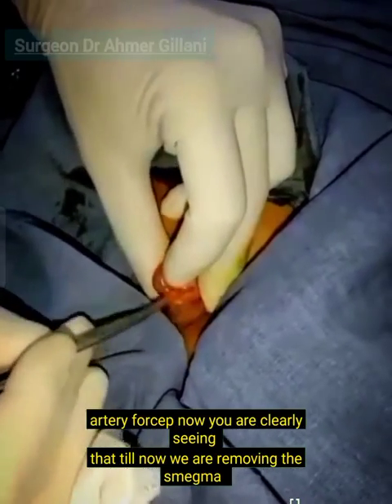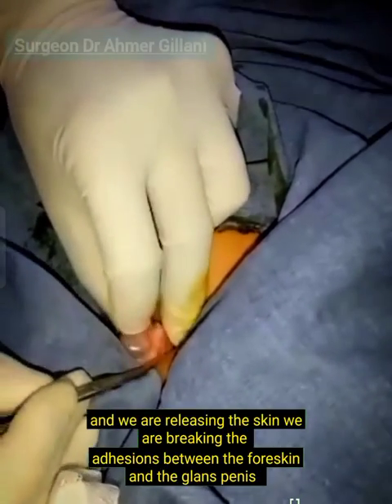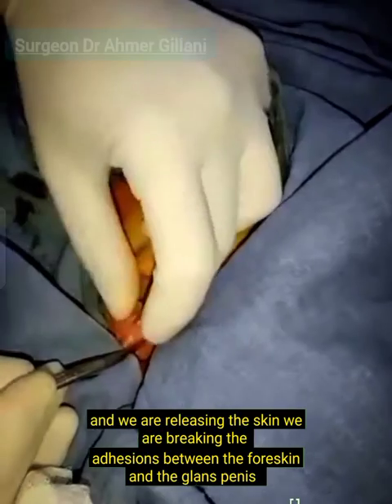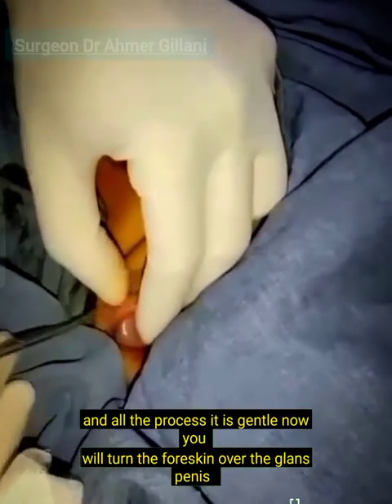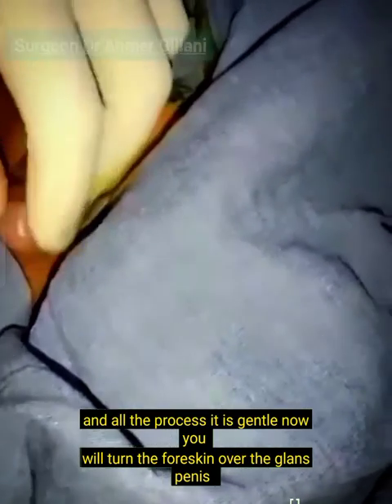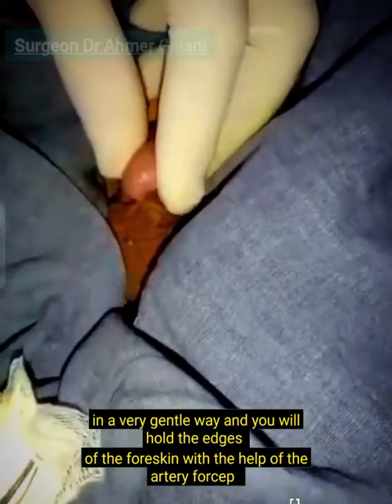You can clearly see that we are removing the smegma, releasing the skin, and breaking the adherence between the foreskin and the glans penis — all very gently. Now you will turn the foreskin over the glans penis in a very gentle way.